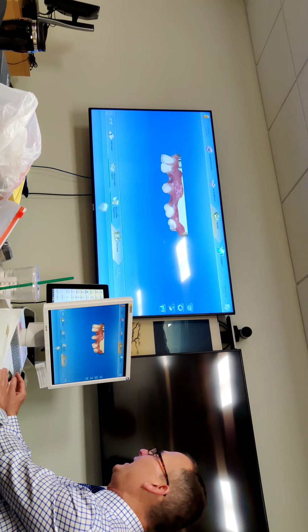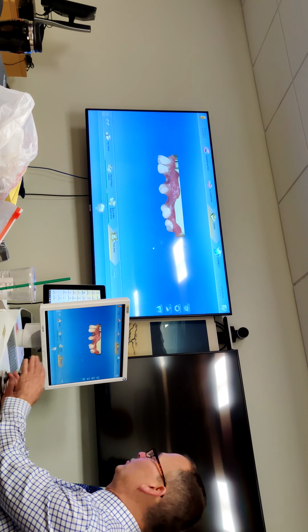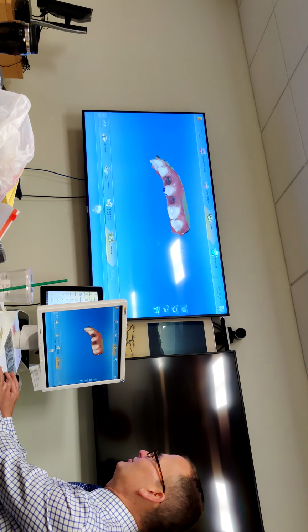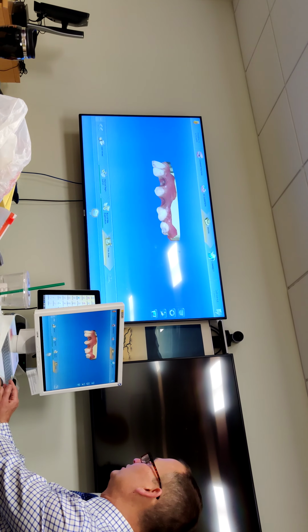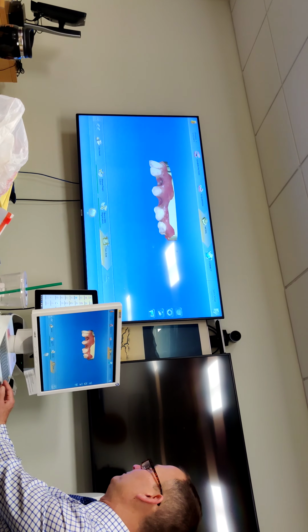Trim. You don't have to trim, like I said, and especially in Cerec Connect, I don't have to trim, because this is just getting sent off. I do want to make sure the bite's right. So see, I can go forward. When we're doing chair side, I'll show you trim. I can go forward.